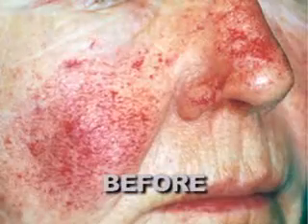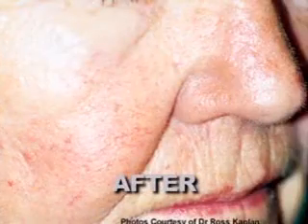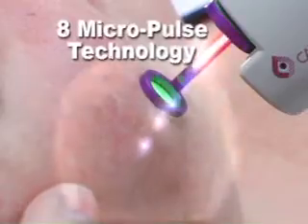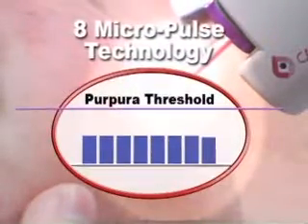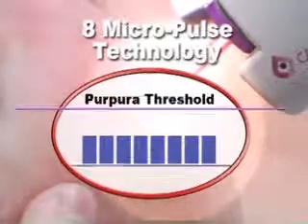Instead of putting all the energy into one small micropulse, at a half of a millisecond approximately, what it does is divide that energy up into smaller pulses that can be divided up over a longer period of time, so you can separate in different times. So what it does, it allows us to deliver a larger amount of energy, but never get to the peak energy threshold that would give us purpura.